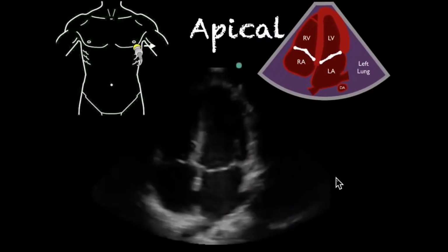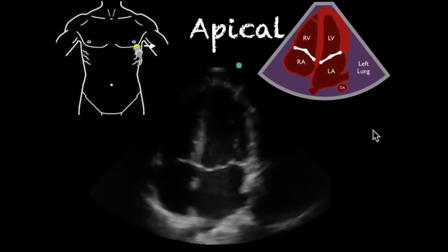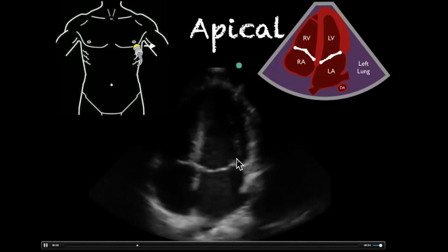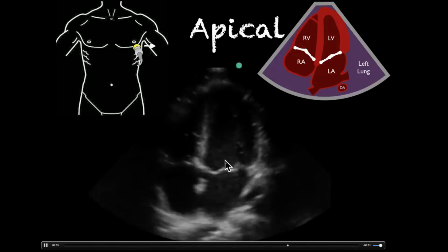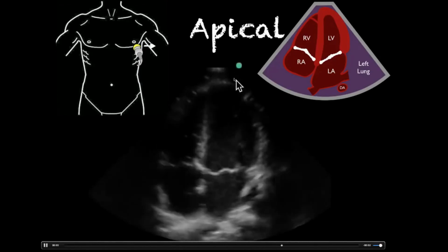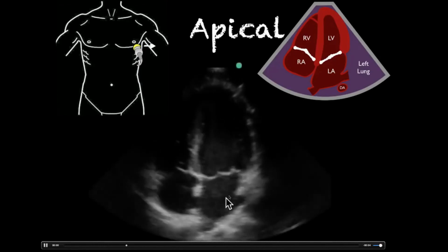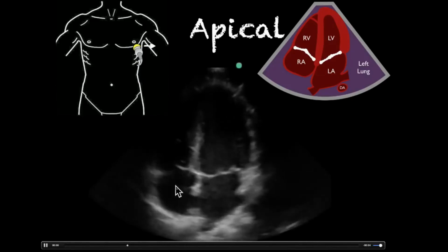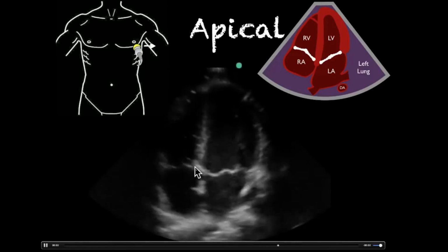So if we go to an ultrasound here, we can see this left ventricle. It's nice and thick. We can appreciate this little inner wall here. Valves flapping up in there. It's collapsing well. This image, the gain could have been a little bit better distributed. It's a little bright down here at the bottom, but we can appreciate the left atrium, right atrium, and we see our right ventricle.